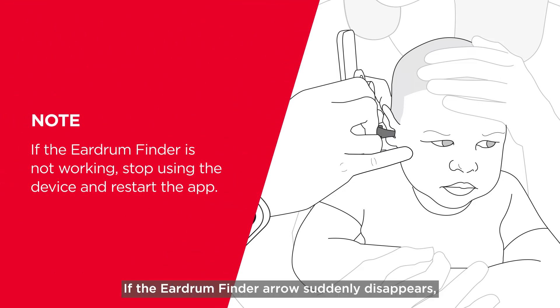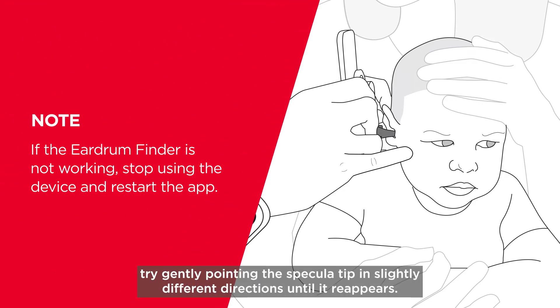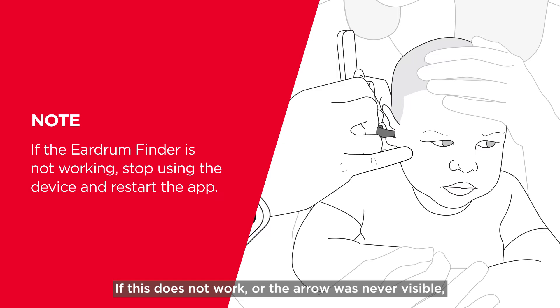If the eardrum finder arrow suddenly disappears, try gently pointing the specula tip in slightly different directions until it reappears. If this does not work or the arrow was never visible, remove the device from the ear and restart the app.